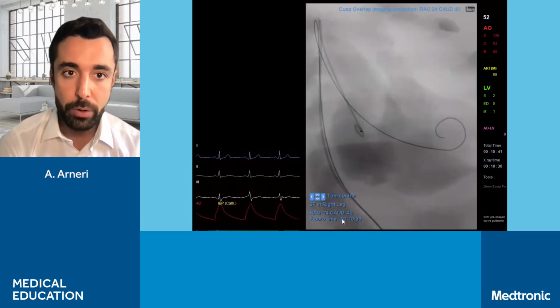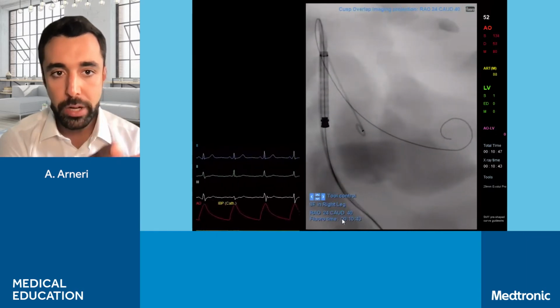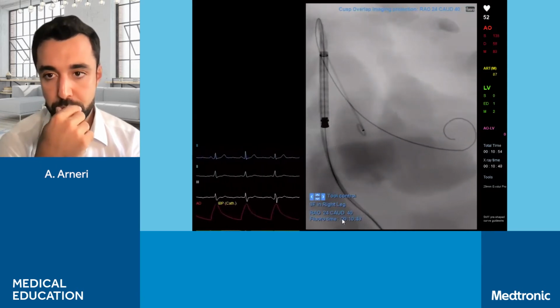So we're going to insert now our device, and we're going to stop right before the crossing of the aortic arch. Okay, when you are here at this point, we can stop, George. And before crossing the arch, it's important to go in LAO projection.